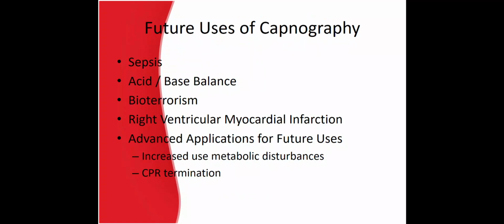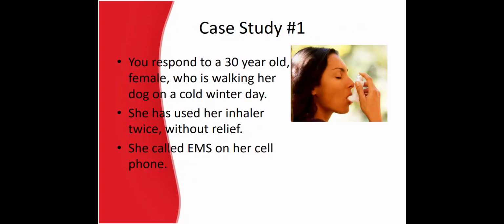Research is continuing to investigate capnography's use in sepsis, acid-base balance, bioterrorism, right ventricular myocardial infarction, and advanced applications for future uses, such as increased use of metabolic disturbances and CPR termination. Let's look at some case examples.